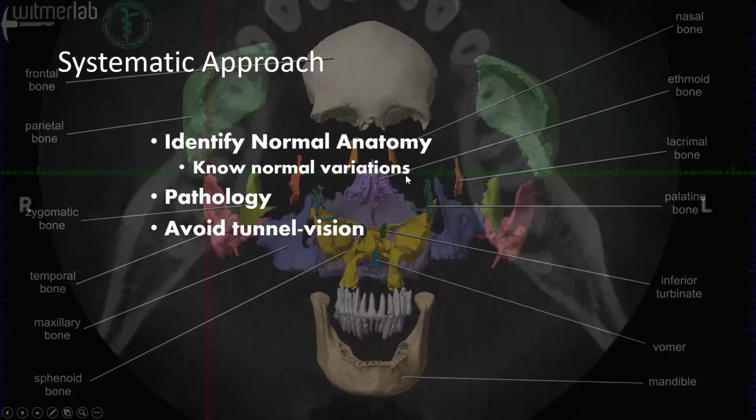And then you can really just refer out times when you see something that's more abnormal, right? And then if you do see pathology that's occult, meaning it's discovered incidentally, or incidental pathology, that's pretty rare, but it can happen. This is a good key here.